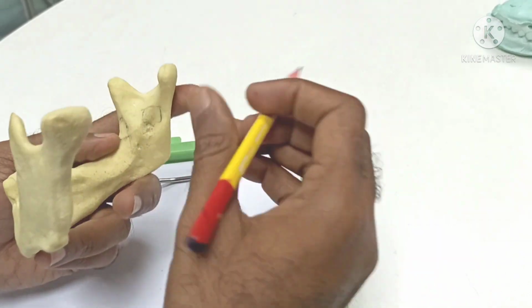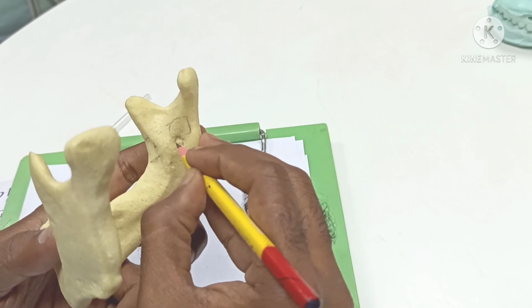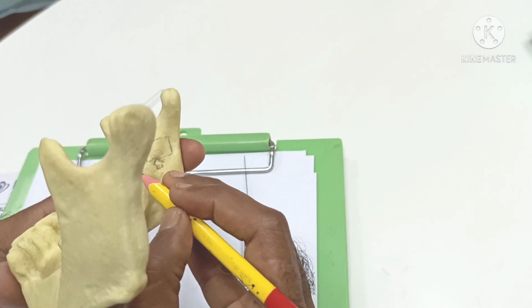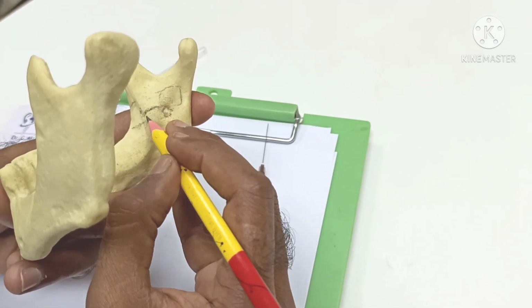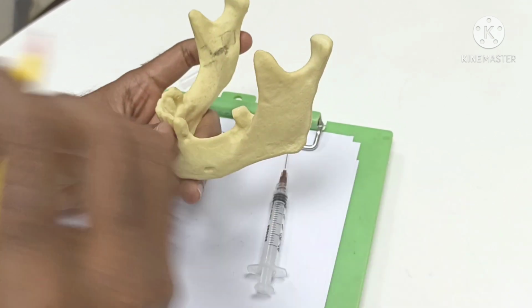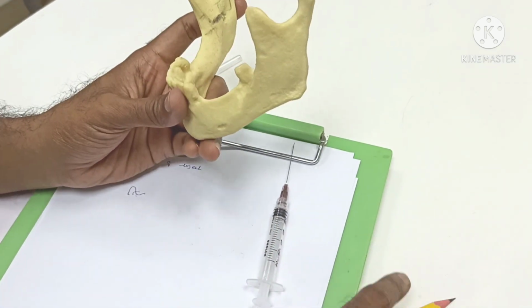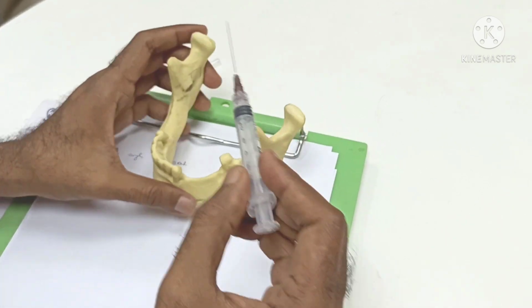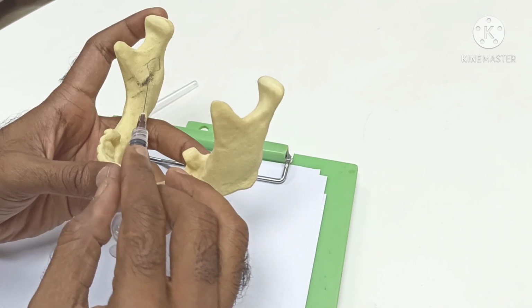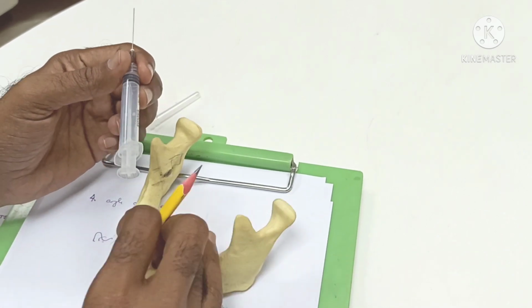Before going into the technique, we will discuss one more thing. There is a foramen here, and just before the foramen there is an elevated ridge. This is a kind of speed breaker, which we have to avoid. So how to avoid it? Sometimes this ridge may be very small, sometimes very prominent. So how do we face these issues? From the opposite premolar, you start injecting, you start entering into the tissue.